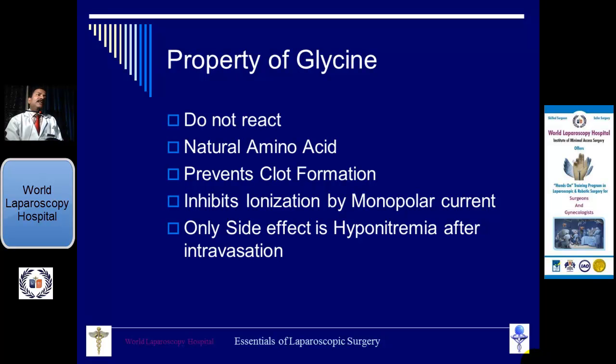Do you know why? Because it can never calculate the amount of fluid which has leaked from the cervix, dribbling through the vagina, going to the floor. So you have to mop it all up and collect it into one bucket and then measure how much it is. This is the rule. But generally we don't follow it, and we calculate roughly that much is the deficit. So this is how to prevent.